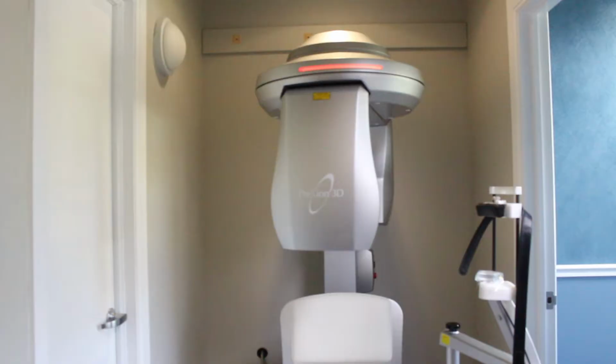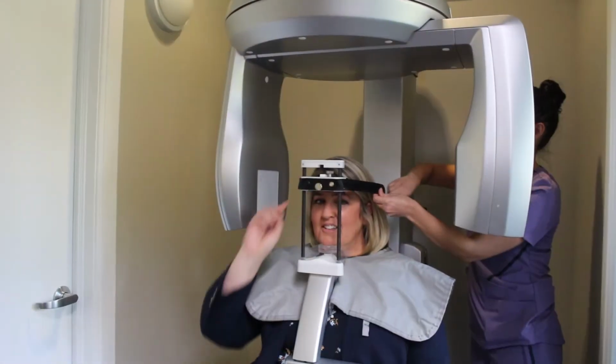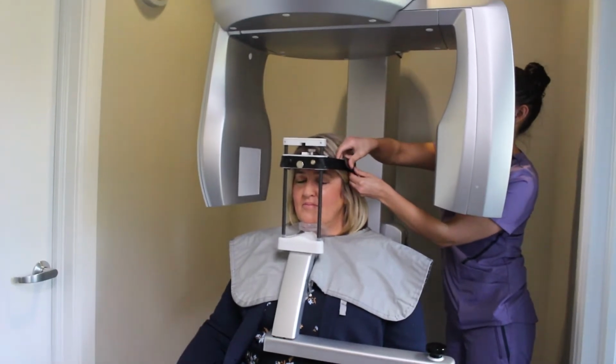Dental implants are something that have been around for a very long time. In fact, probably over 1,000 years. I would never do a dental implant, though, without taking a cone beam CAT scan. What is that? Well, it's a three-dimensional image of the jaw.